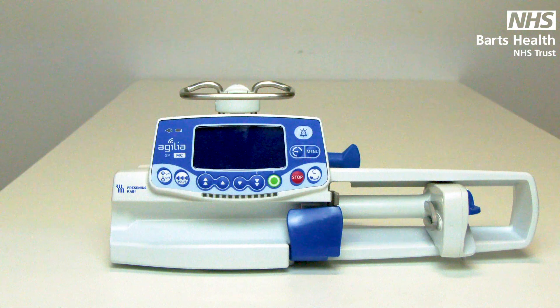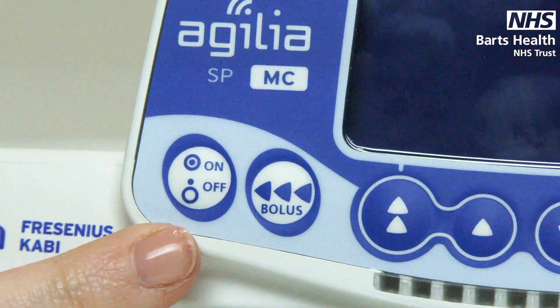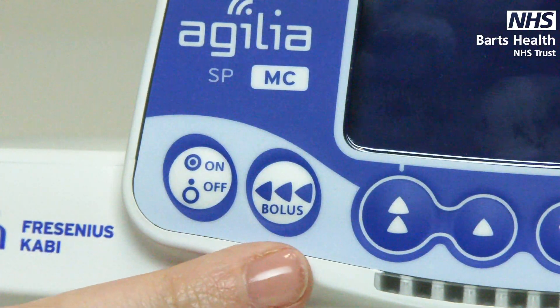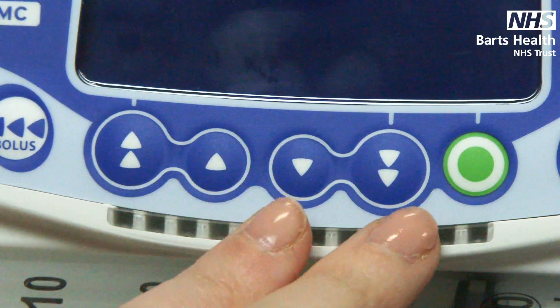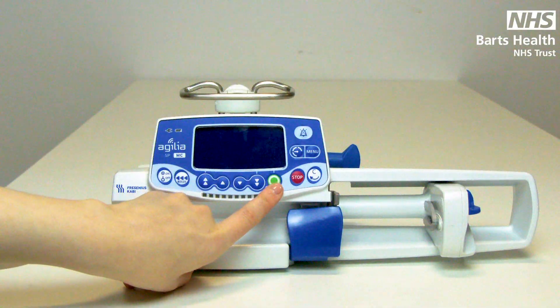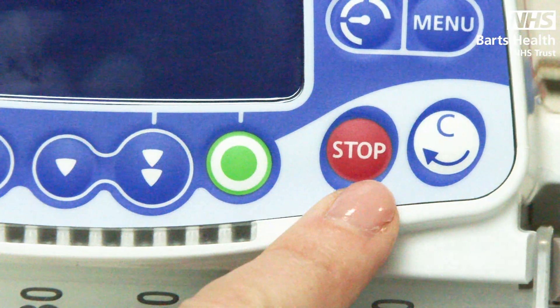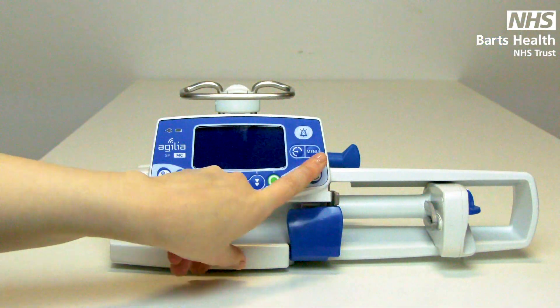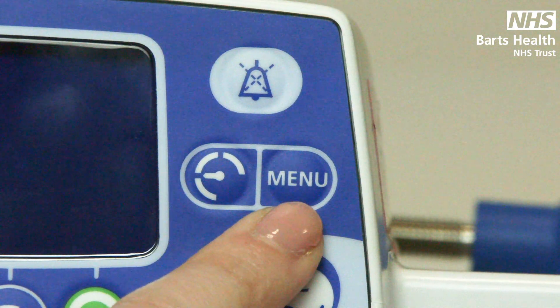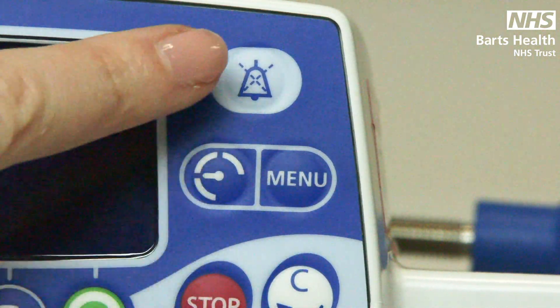On the front, the soft keys are as follows: on, off, bolus, increment keys, decrement keys, green is go/confirm/start, red is for stop, C stands for cancel/change, menu, shortcut to line pressures, and silence.